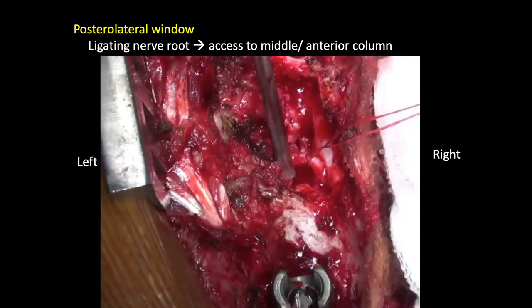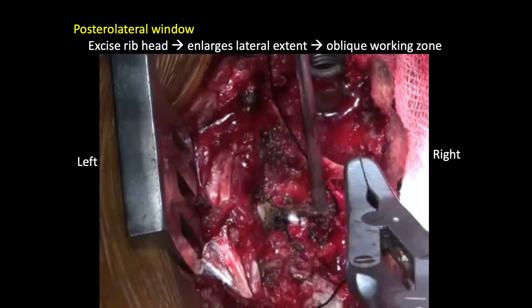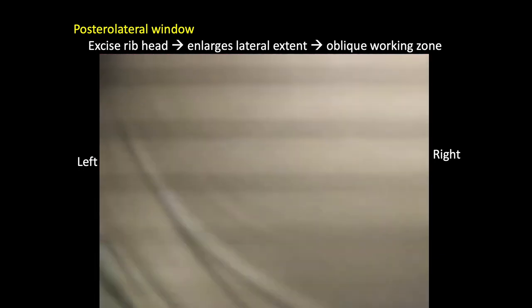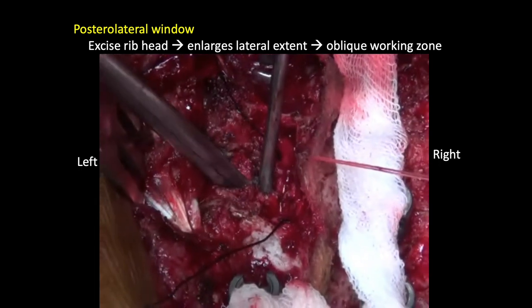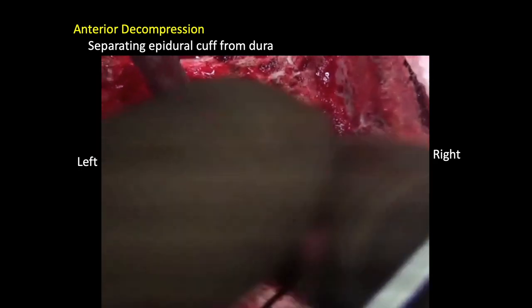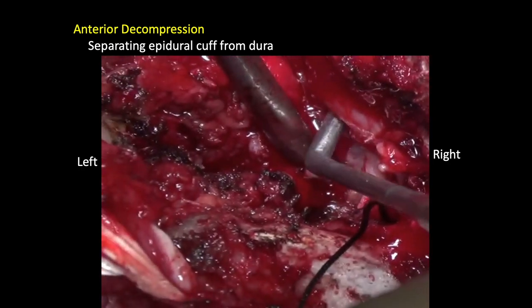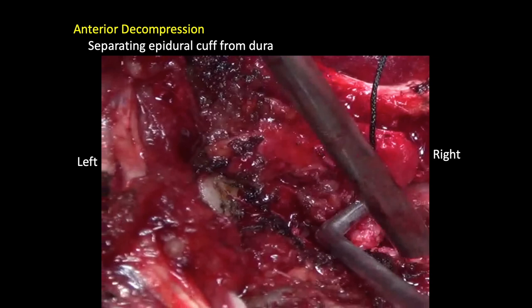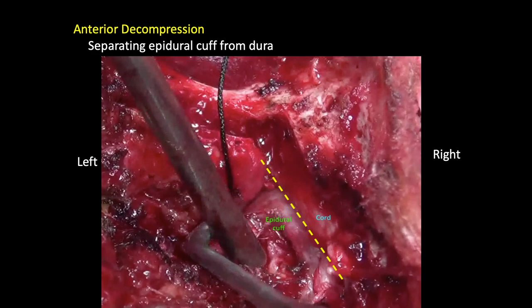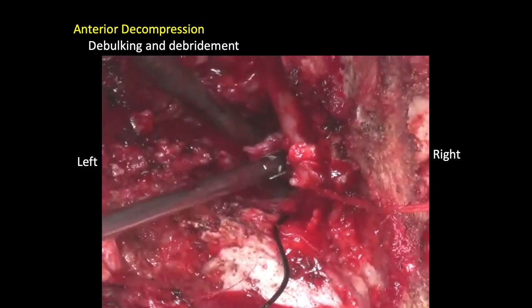It also avoids a tear in the axilla, especially with vigorous retraction of the nerve root, which is very difficult to suture. The rib head can be excised to enlarge the lateral extent of the window and helps in creating an oblique working zone to safely insert the tricortical graft or cage right anterior to the cord in the middle column. Once that has been done, the nerve root which has been tied can be lifted with the tie and the epidural cuff or PLL can be dissected from the anterior margin of the dura. Make sure you dissect off this PLL or epidural cuff right up to the opposite side before you plan to excise it. The rest of the anterior decompression in the form of debulking and debridement is done in the usual fashion as in an anterior approach.